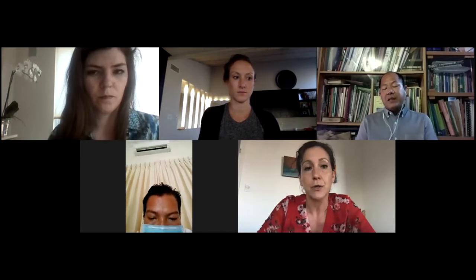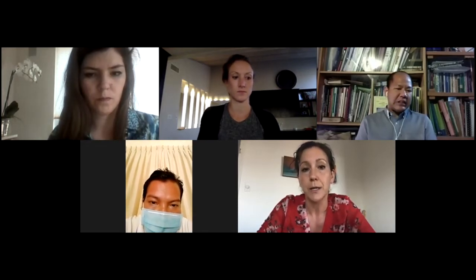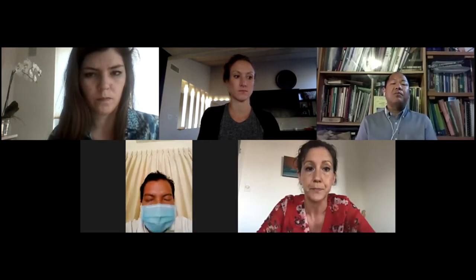Also important, once you have a patient on oxygen, is to continuously monitor using pulse oximetry. As that patient improves, you can start to titrate down the level of oxygen. So if you start off on a non-rebreather or oxygen mask with reservoir bag at 10 liters per minute, and your patient's saturation is 100%, then you may want to decrease the oxygen delivered, and that may require a different device or just a lower level of oxygen.